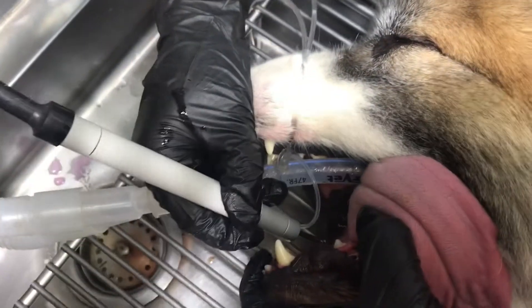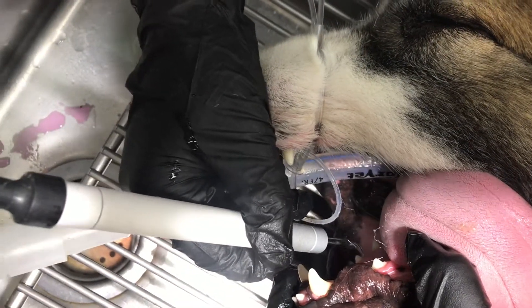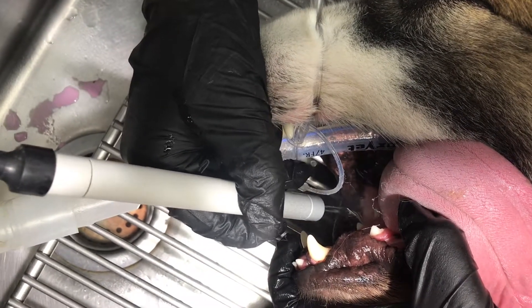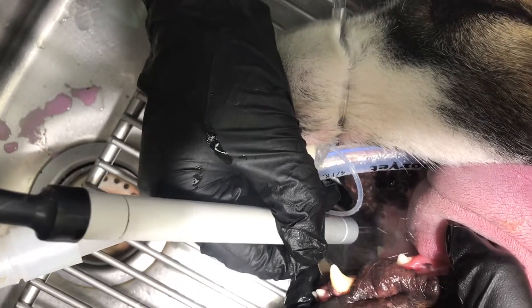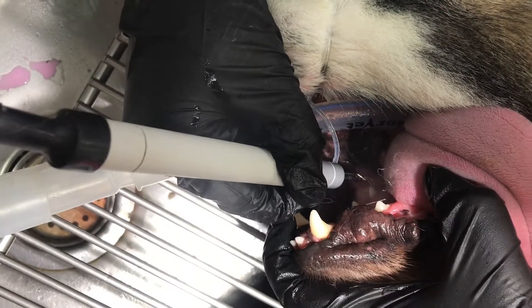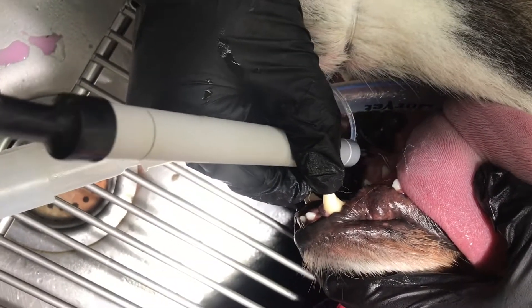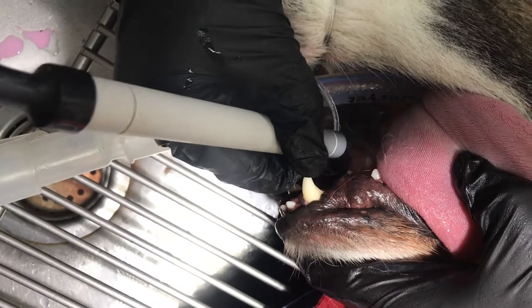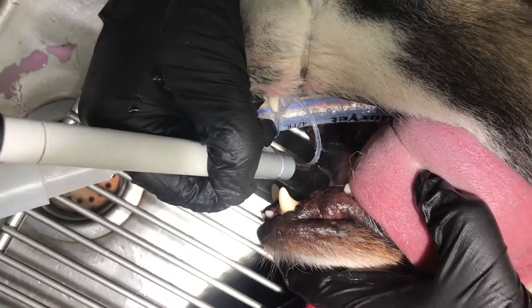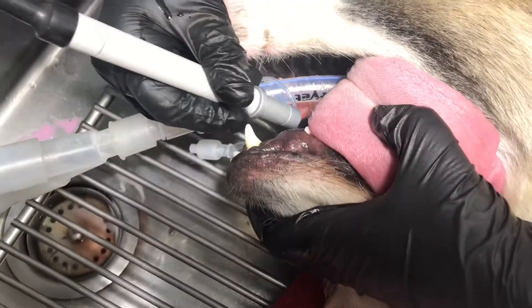You'll notice that Sarah is scaling right now on the inside of those arcades of teeth. That is something that's going to be pretty near impossible to do without anesthesia, with a big tongue like Levi's got. You saw how he was wiggling just putting the IV in — you can imagine having a sharp instrument in a large dog's mouth awake without sedation. Even at the level he was sedated with the pre-anesthetic, he's still going to fight and move. You're not going to get a good clean scale, you're always going to leave something there, and there's a very real possibility of causing damage with a sharp scaling instrument.